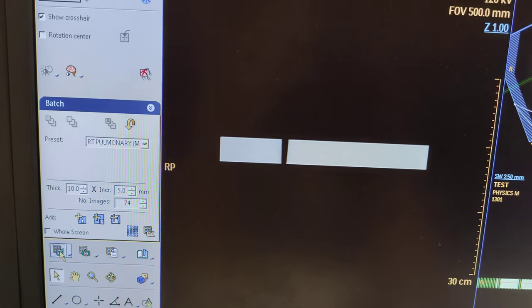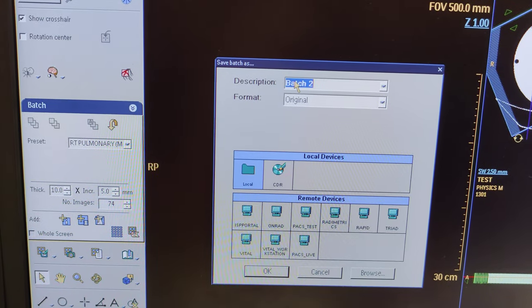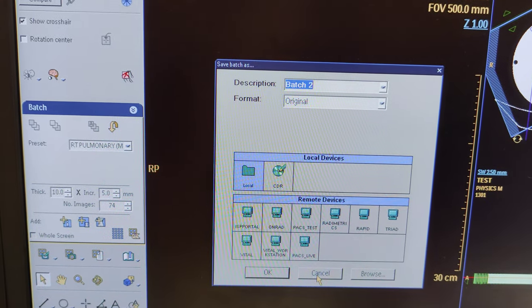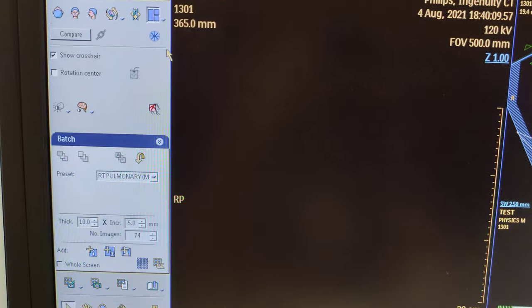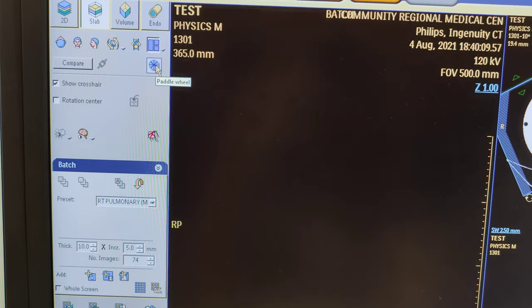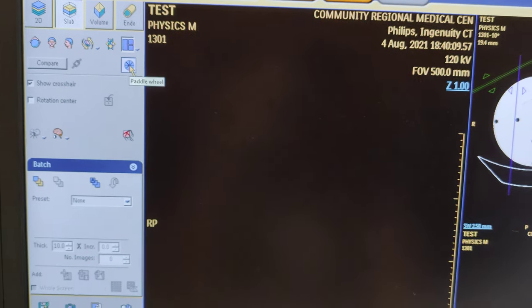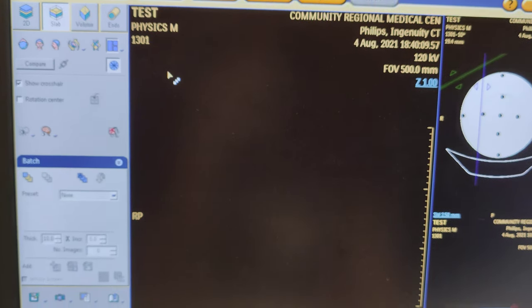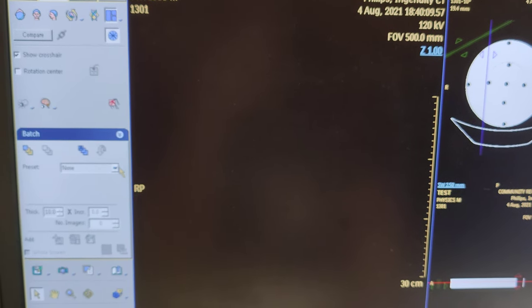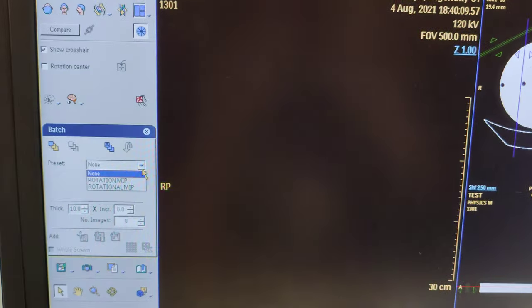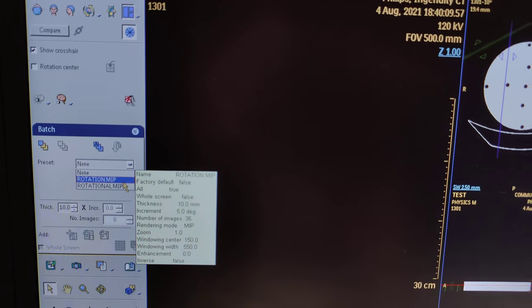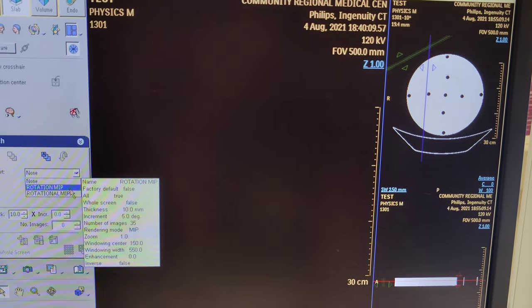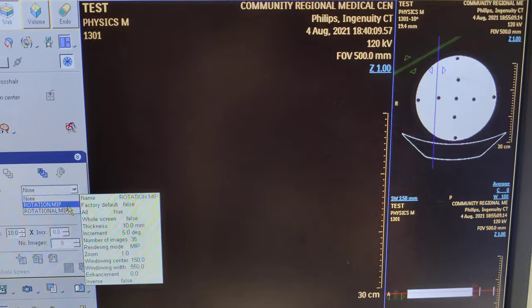After that, you need your rotation, so you're going to click rotation and then rotational MIP. This corner over here is going to change.